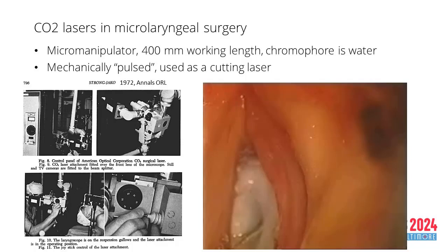They told me that initial CO2 laser was the size of a current kitchen refrigerator, and that it required trips from the residents assigned to the case to the cafeteria to come back with buckets of ice to pour into and around the laser casing in order to cool the laser during the surgery, right? So clearly we've evolved since then.